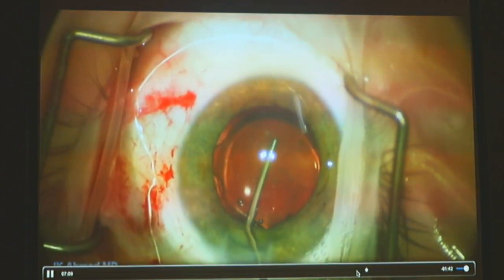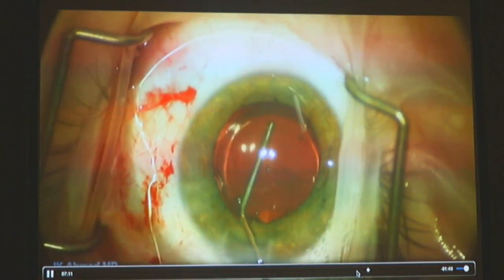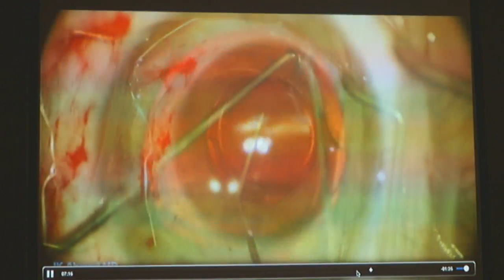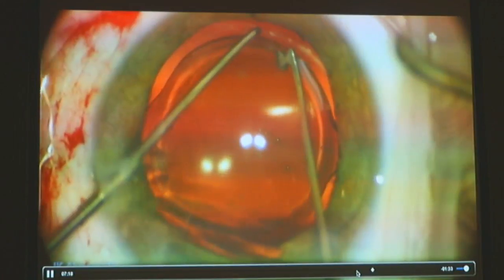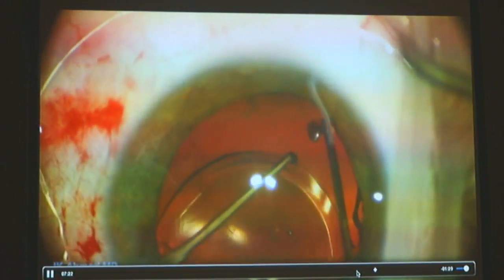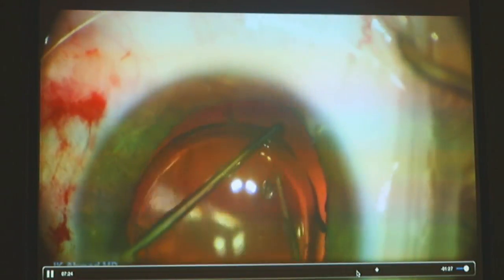I am not a fan of doing vitrectomy if I don't need to, or opening up more than I have to. So I find that we have the lens in between the capsule and the anterior hyaloid. It fits in very nicely, and some of you may say, how can you do a capsulorhexis when the CTR is in the bag? Will it not run out? Actually, no, it actually goes quite well.